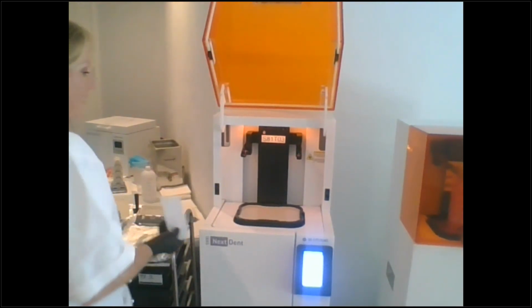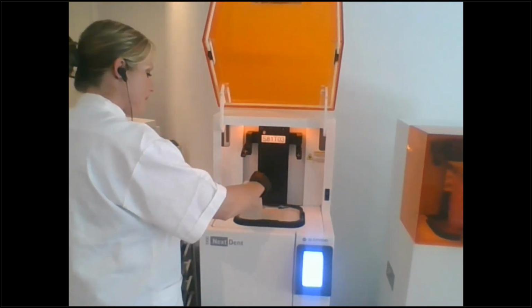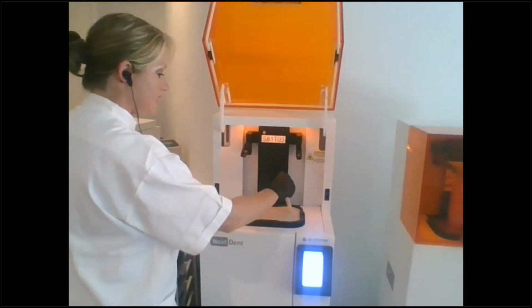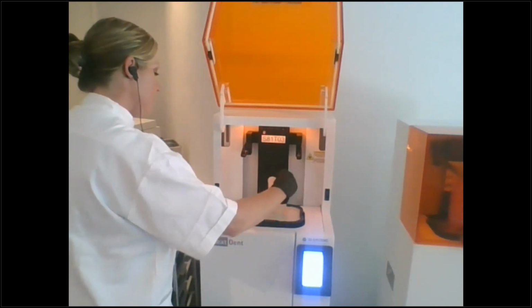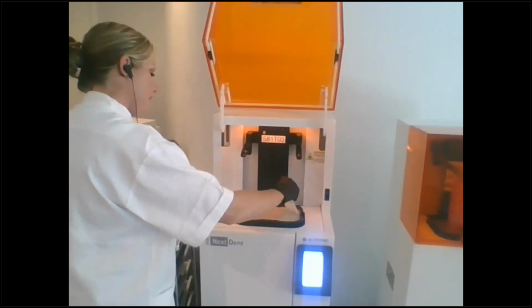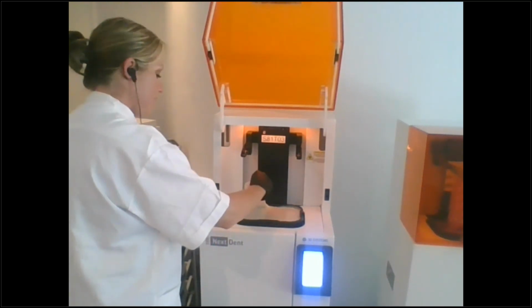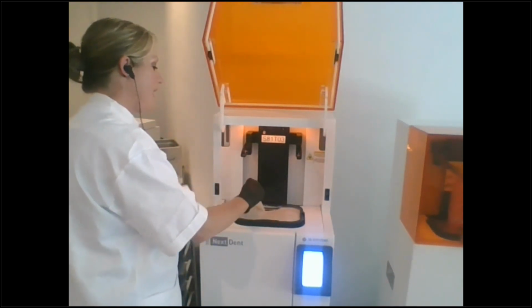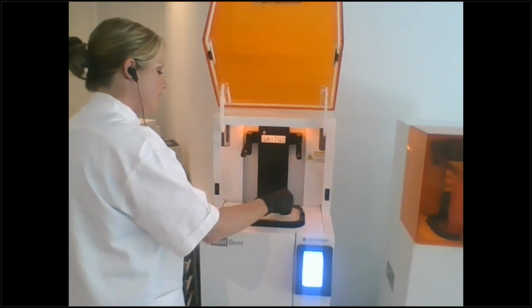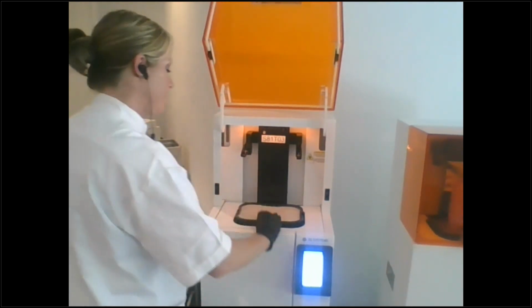Now, if you're adding new resin to older resin or resin in your tray, make sure you give it another mix. We have a stirring and mixing chart, and I'll show you that too. Okay, so give it a mix and make sure that's all mixed up. If you're doing biocompatible, you don't want to mix lot numbers. So make sure that if you're adding or topping off, that you check your lot numbers. That's just right on the side of the bottle, right by the barcode.